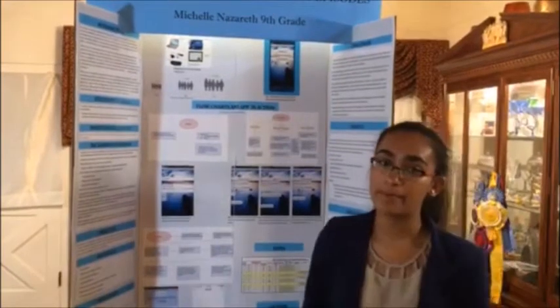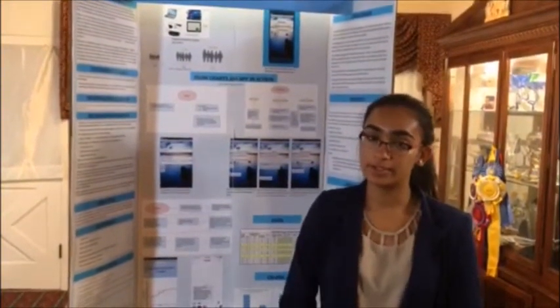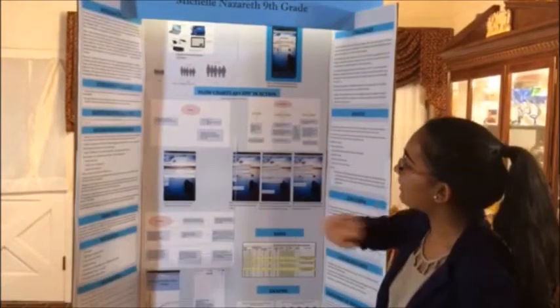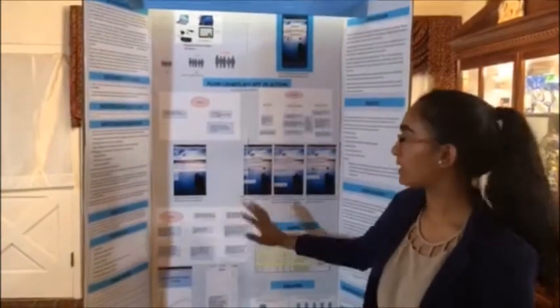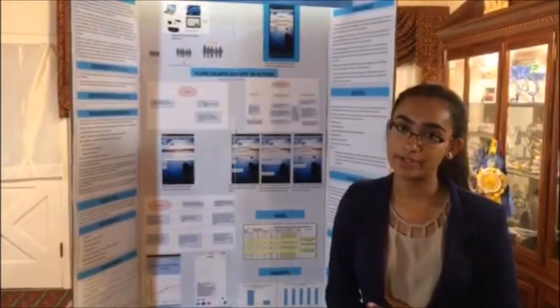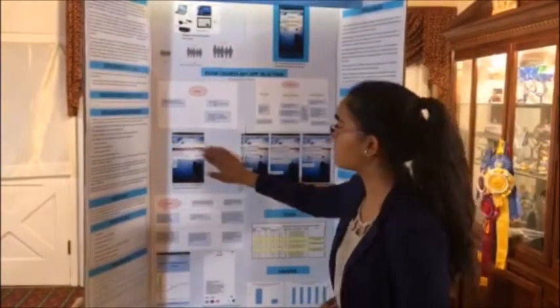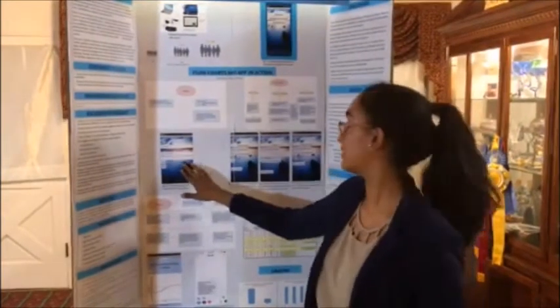So overall, my app is able to read and track heart rate, graph this data, play music to calm the child down, use user-entered information, and send out a text to a caretaker in emergency. So my app has three main screens, a reading screen, a customization screen, and a settings screen. The settings and customization screens are mostly for user-entered information to make sure the app is really customized to you. So here in the settings screen, you can enter your name and the emergency numbers that will be used later to send the text out to.